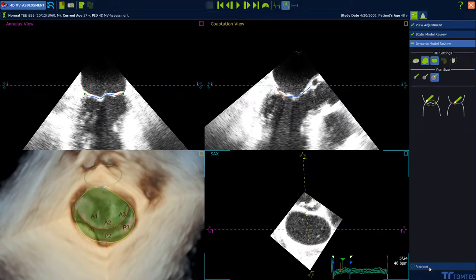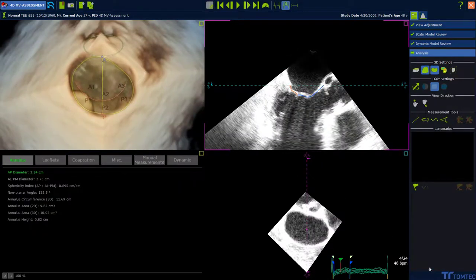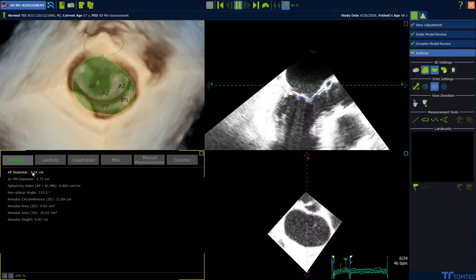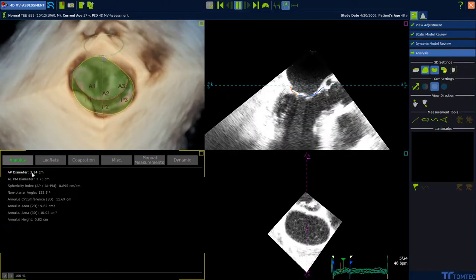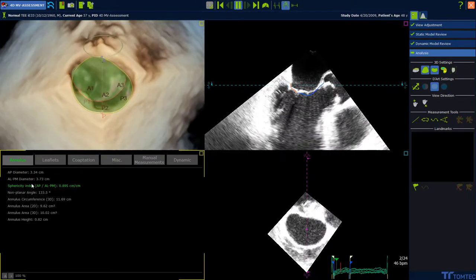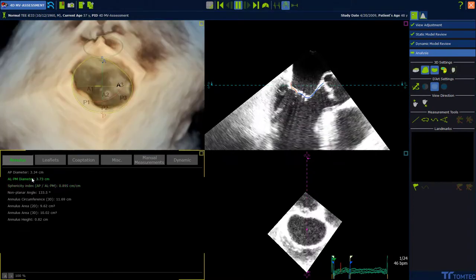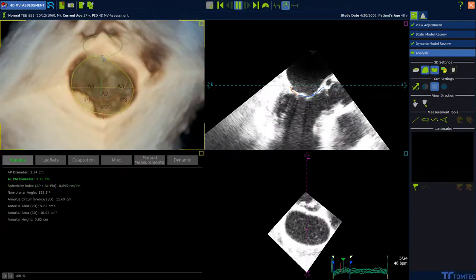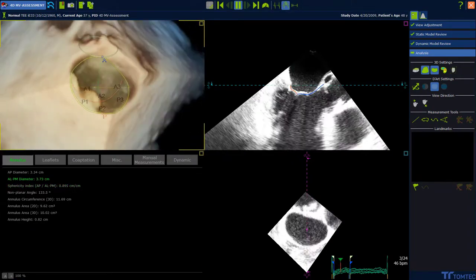Select analysis to conclude the analysis. Find the measurements on the left side under the topics. Click on a value and the measurement will appear in the dynamic model.